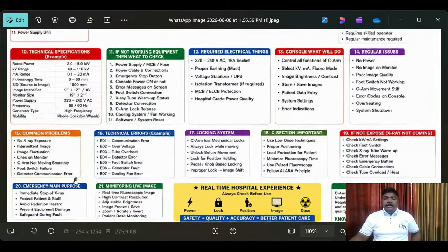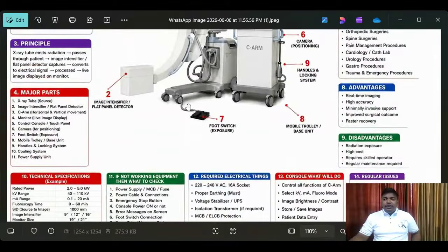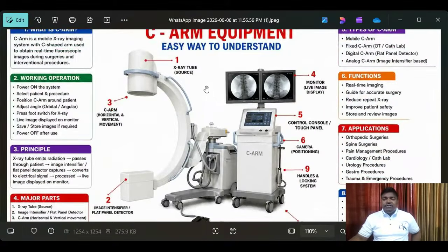Next, see here. I am showing you all this information. If I share it with you normally, you cannot understand. If I explain it in a practical way, definitely you will have very good confidence. Yes, one senior person is there. If I go there, definitely support will be there. At that time you will get a positive mind.